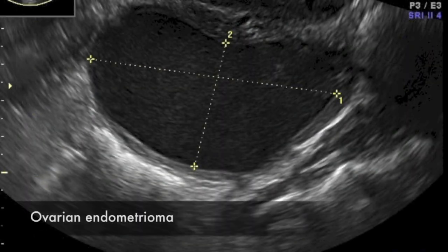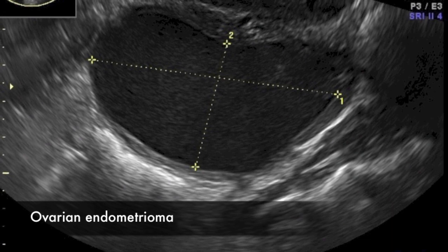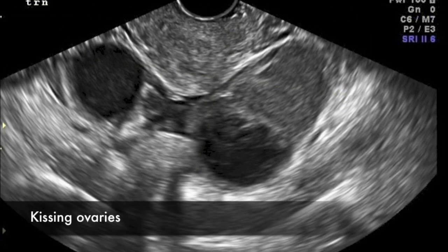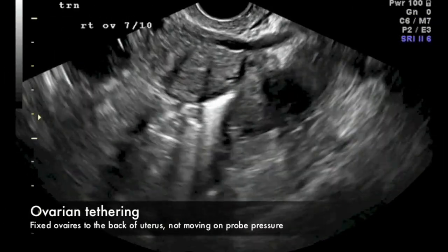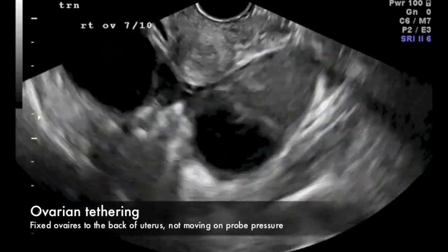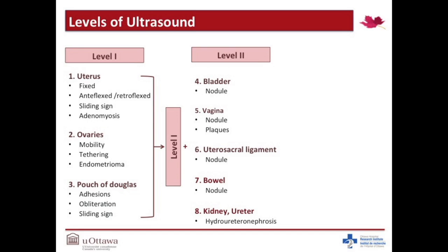Ovarian imaging can commonly reveal ovarian endometriomas and sometimes can show both ovaries tethered to the back of the uterus, known as kissing ovaries. Pressure applied by probe shows a negative ovarian sliding sign, suggesting ovarian adhesions. When uterine and ovarian markers are seen, a level 2 ultrasound should image other organs to look for endometriotic involvement.